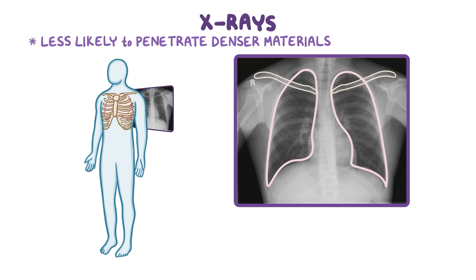Let's go through this chest x-ray using an easy-to-remember checklist associated with the first seven letters of the alphabet: A, B, C, D, E, F, G.